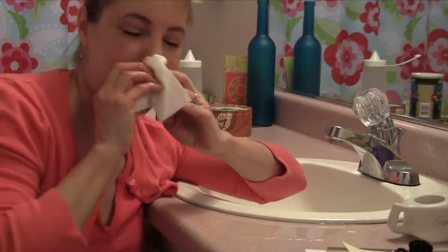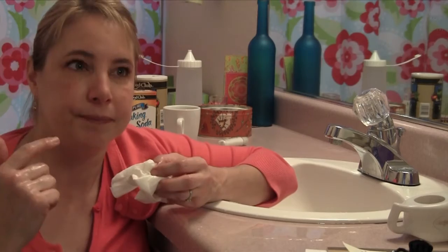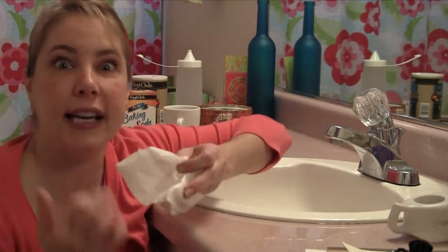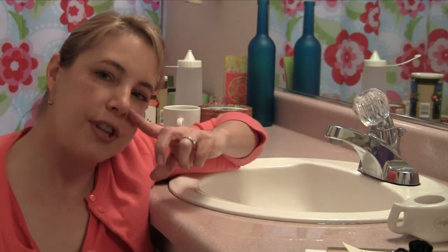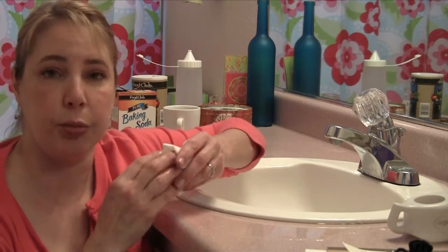Okay, so what happened is I went in through the side that I felt like was clearest. So if I had a little bit of a blockage in my sinuses on this side, I don't want to shove that back into the middle of my sinuses. So I pour in the other side to push that blockage out, right? And now I'm going to wait a little bit. I don't actually want to go doing the other side too fast. Let me turn this a little so I can see a little better.